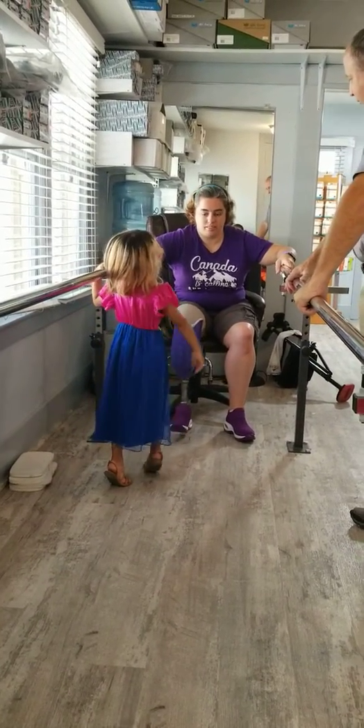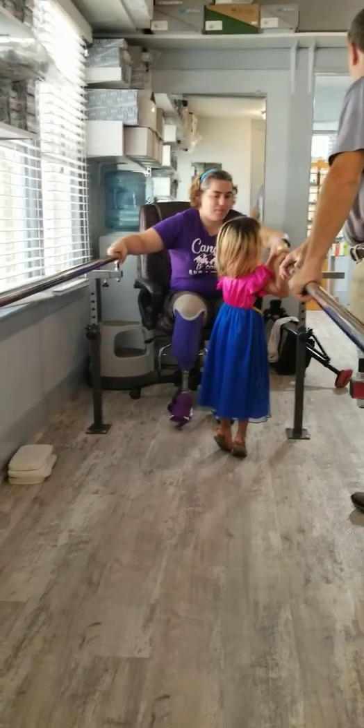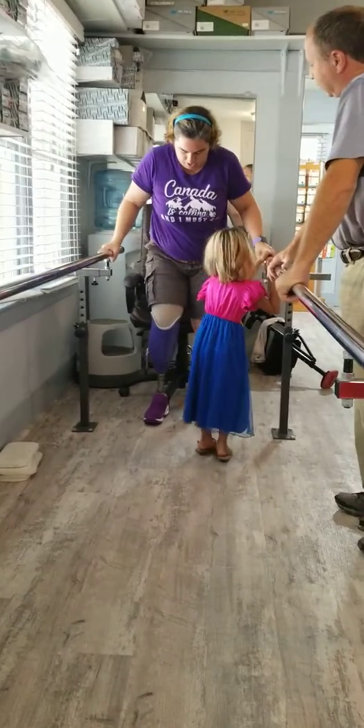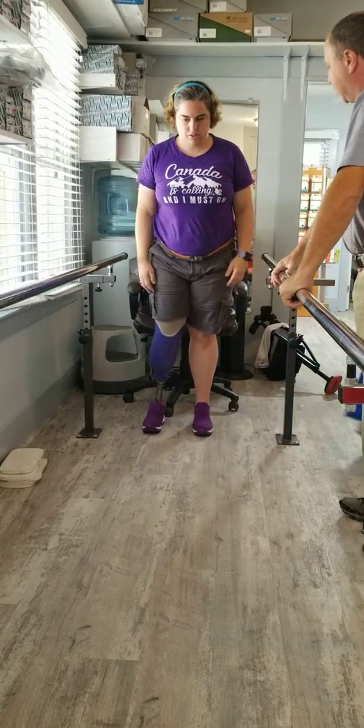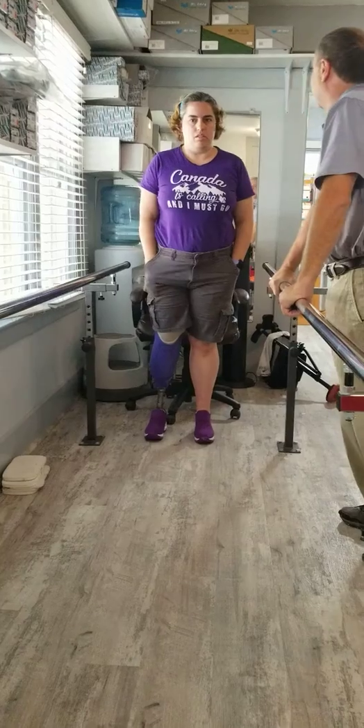This is the loaner foot, but it's the socket that she's using. Mom, you get to watch your daughter's first steps again, and the kiddos get to watch their mama's first steps.